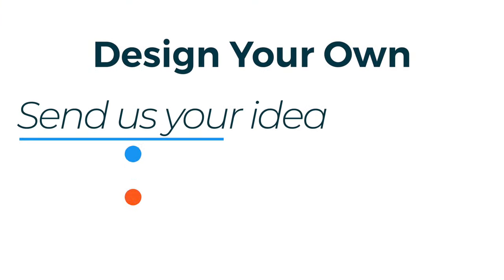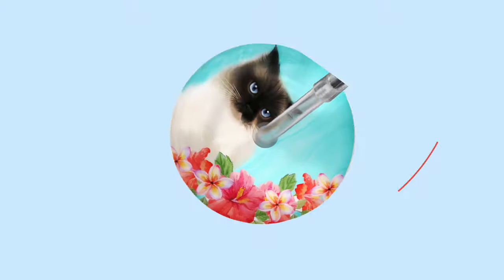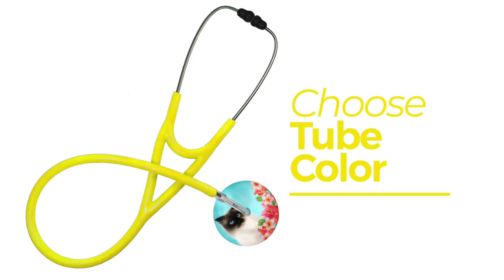Simply send us your idea — a custom doodle, photo, or color scheme — and our team will work up something magical. Once you confirm your design, choose one of our colorful tubing styles to complement your custom head.